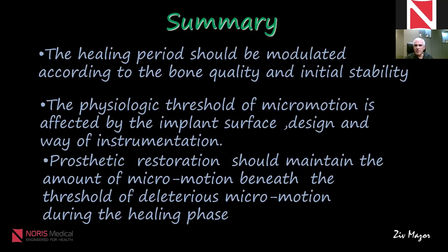As for a summary, the healing period should be modulated according to the bone quality and initial stability. And the physiologic threshold of micromotion is affected by the implant surface, design, and way of instrumentation. As for the prosthetic restoration, it should maintain the amount of micromotion beneath the threshold.